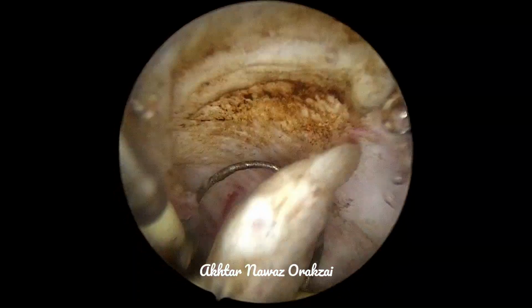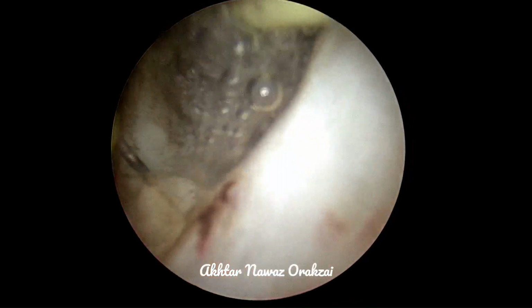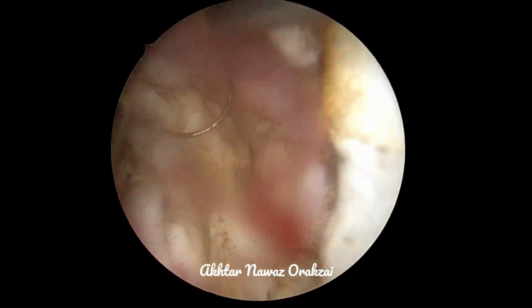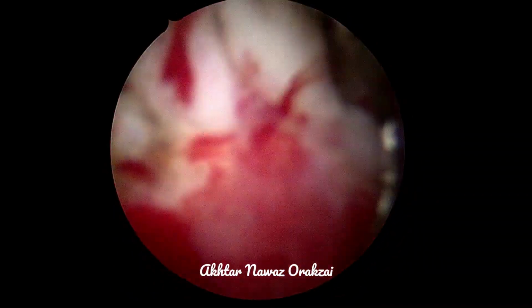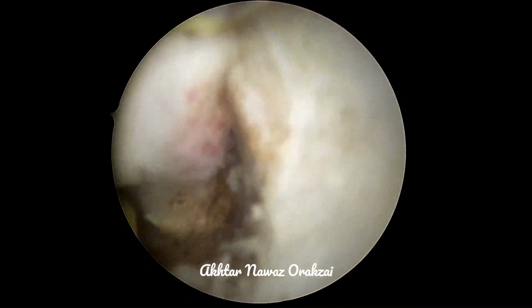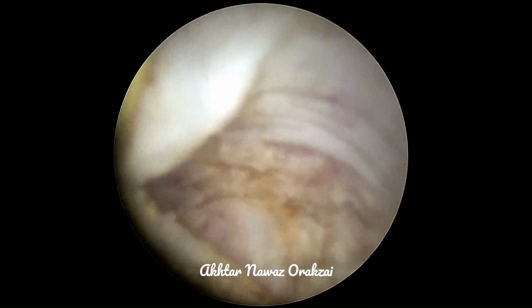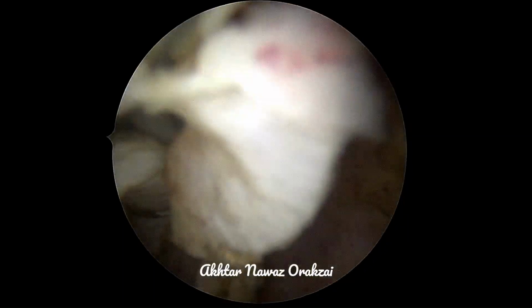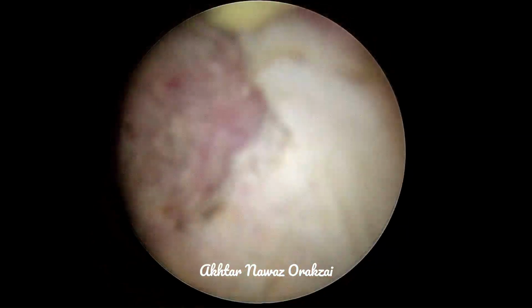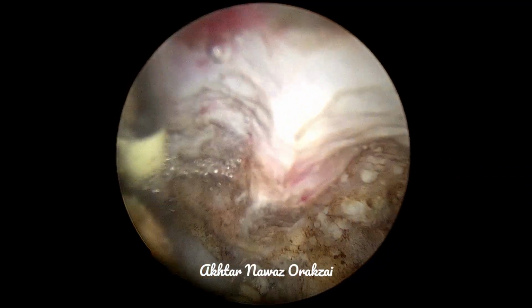Since the ultrasound was showing a 115 gram prostate in this patient at presentation, we gave him a combination therapy of dutasteride and alpha blockers. He used it for a good 4 weeks, and now you can see very clearly the effect of that dutasteride: the prostate is not juicy at all, and it is not bleeding as one would expect from a big prostate.